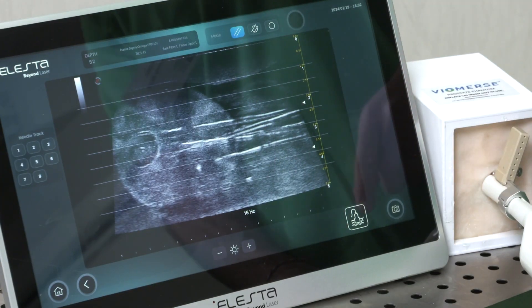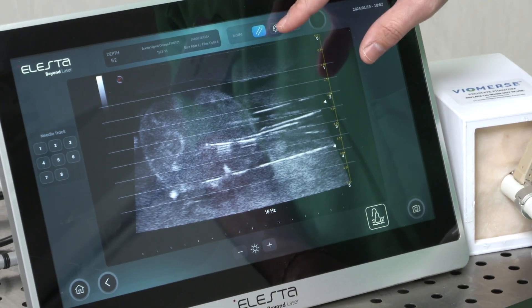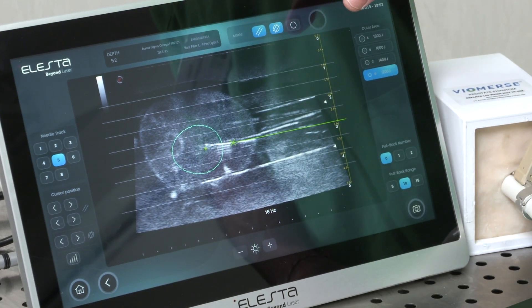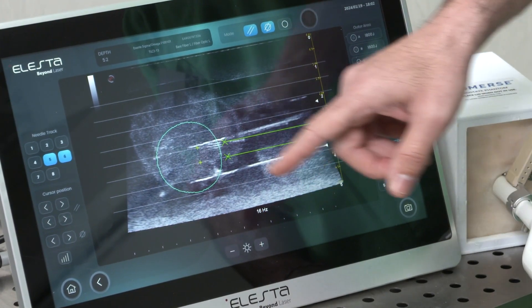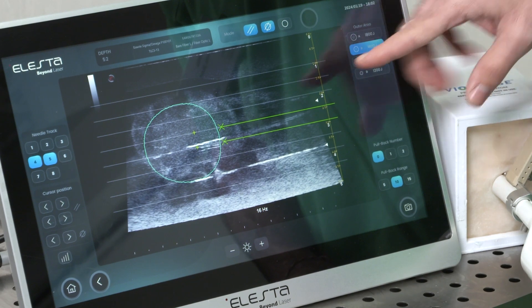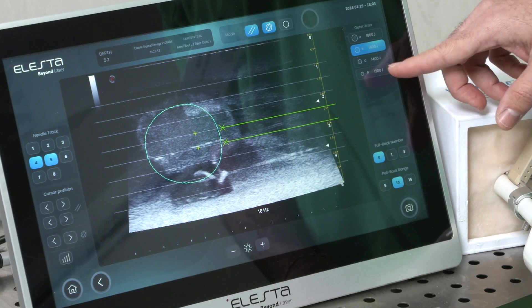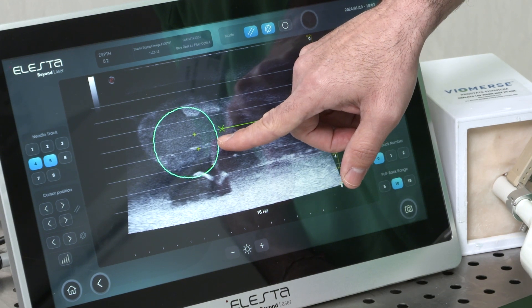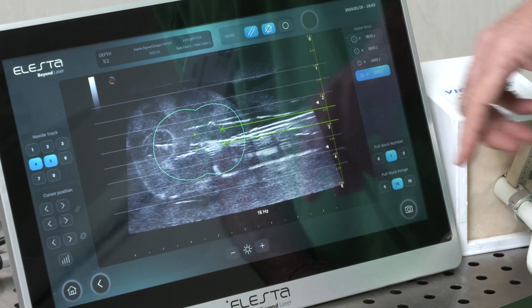In this first step, we see the lines of the needle guides. In this second step, you can select what needles you need to treat the patient. You can select two needles at the same time, modify the joules, upgrading the ellipsoidal shape of treatment, and also you can move the selected area or add a pullback to treat longer prostates.